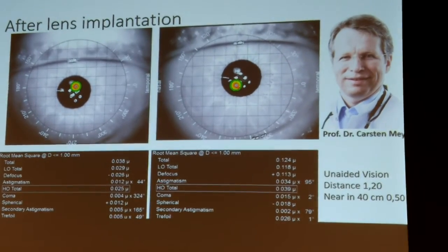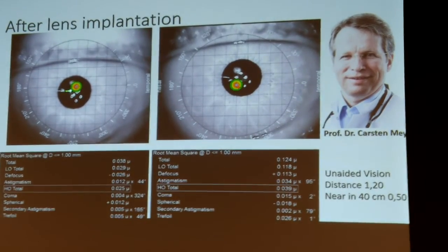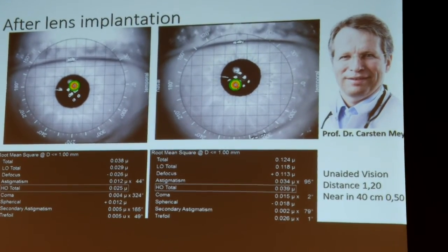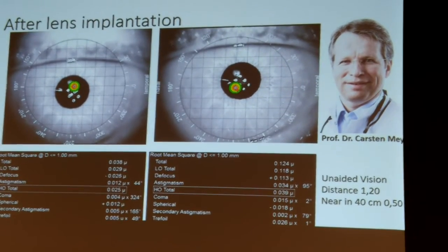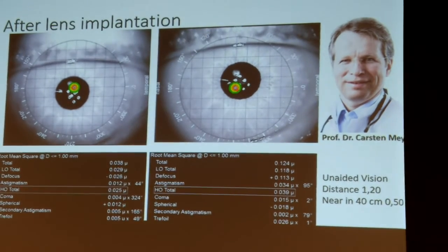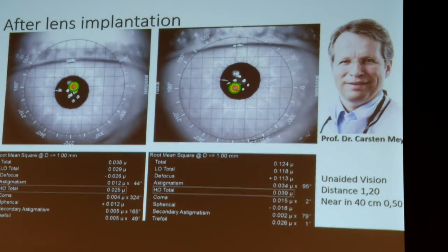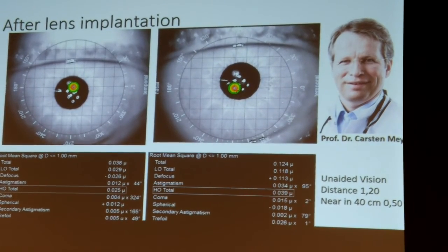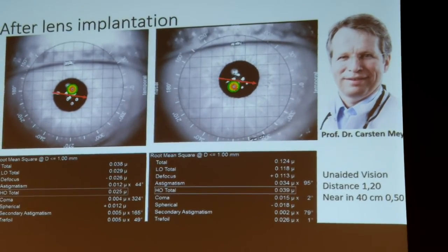And the nice thing is, this was a talk as well today at the Oculentis meeting from Professor Hoon. With the eye trace, you can use... The problem is always the objective refraction. With any multifocal lens, it doesn't work. It gives you wrong numbers, whatever pops up on the screen, and even if you do a great job, it tells you +2, -4 in an axis. With the eye trace, you have the opportunity to do a 1 mm scan, and here in this case you see the line, basically the reflex where the transition zone is, so I highlighted it here in red.